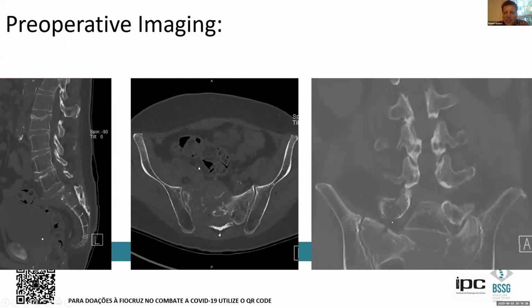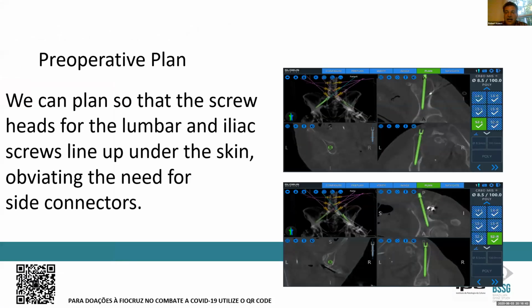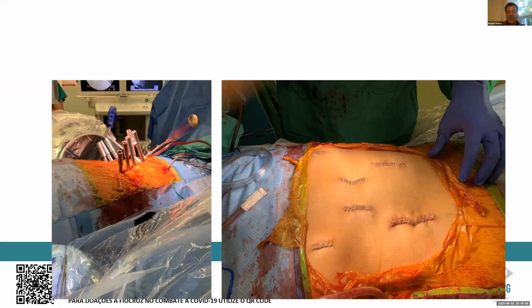to instrument. But we can actively plan out screws that are reasonable, including iliac bolts and aggressive screws into the ilium that are all pre-planned in multiple planes, and also guiding where the screw heads go to simplify placement of the rod. So a good case for something to help facilitate, make life easier. Placement of the rod becomes much less difficult, and all done through stab incisions to help with pain.